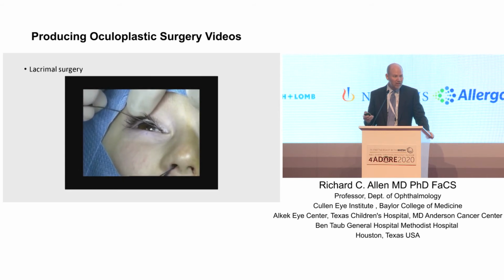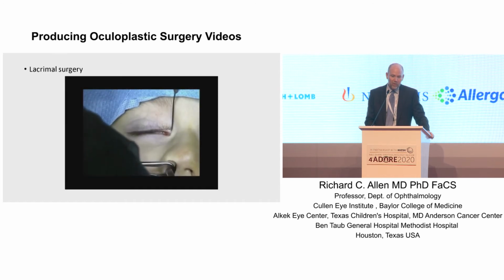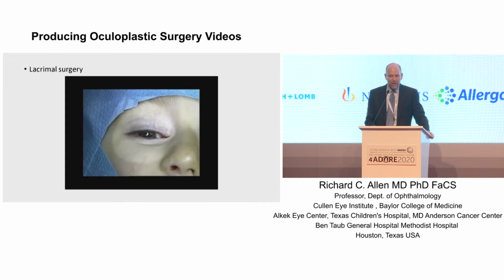Again, almost all endoscopes will have video capability if it's hooked up to a monitor. So in this case, I'm using a combination. I'm just doing a probing of a child for a congenital nasolacrimal duct obstruction. And then what I can do is that I can switch over to the endoscope so that I have a view. So you can see here that there's no view in the nose. There's no real visualization with regards to trying to show exactly what I'm doing.